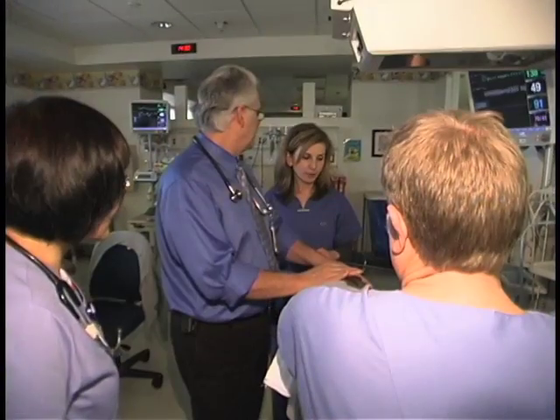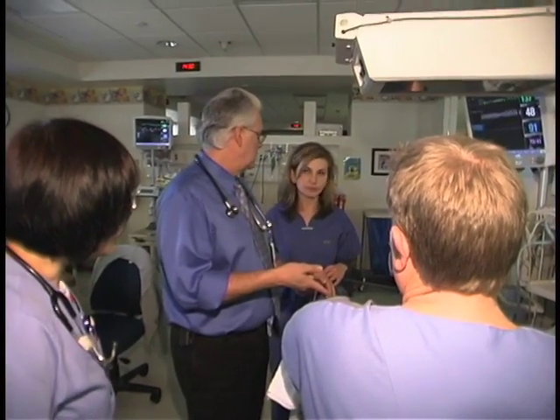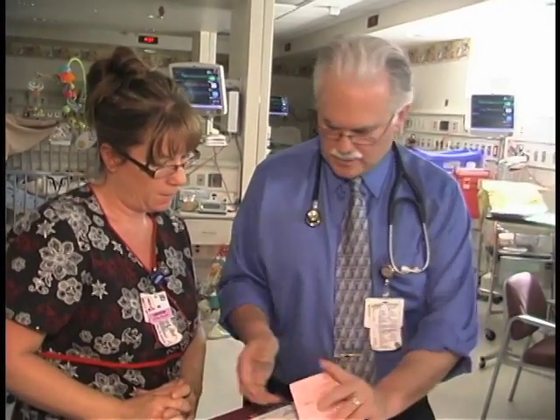Cooling blankets are used in NICUs, neonatal intensive care units, to assist infants who've had perinatal insults. We have a team including a physician, respiratory therapists, and nurses that work closely with the baby over the period of the cooling, which is only 3 days, in order to assist them. And after that, then they're followed in a normal neonatal intensive care unit. Dr. Shaw tells us how he determines who needs a cooling blanket.